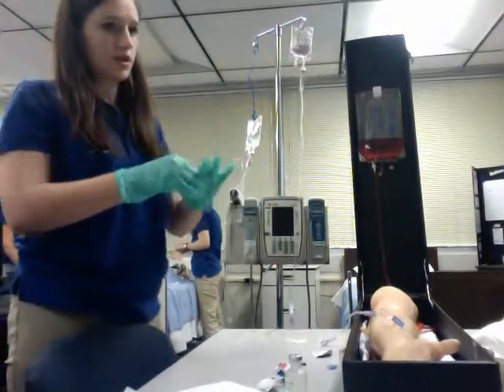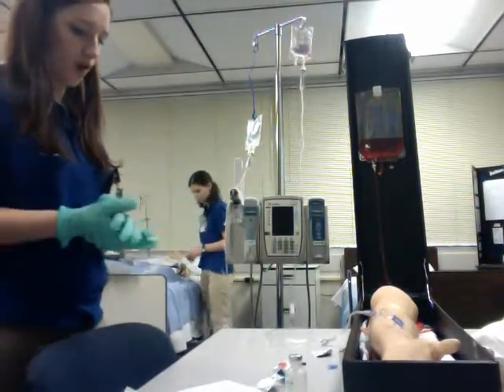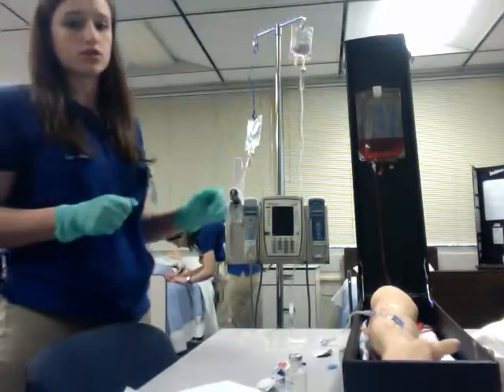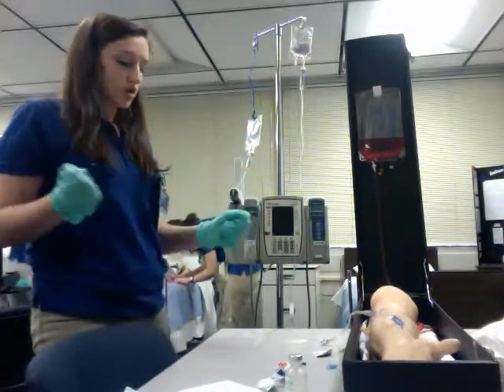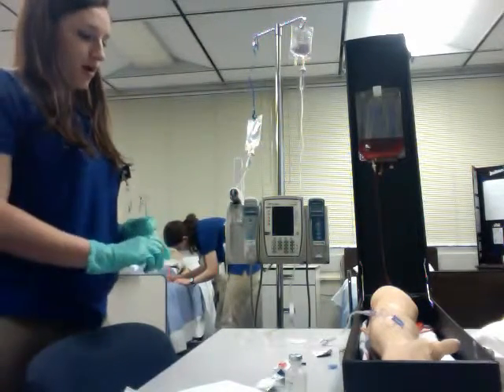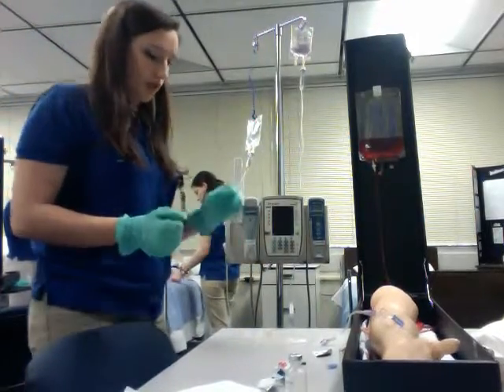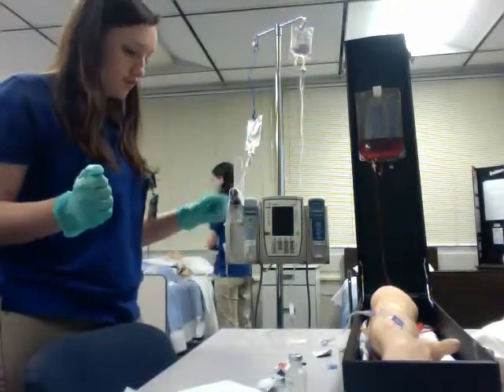I'm going to monitor the IV site and make sure everything goes well for a minute, and then I'm going to leave the patient and come back in an hour after the medication has completely infused. So it's been an hour. I'm going to come back. I'm going to perform hand hygiene again and put on my gloves. We're going to disconnect everything since it's done infusing.